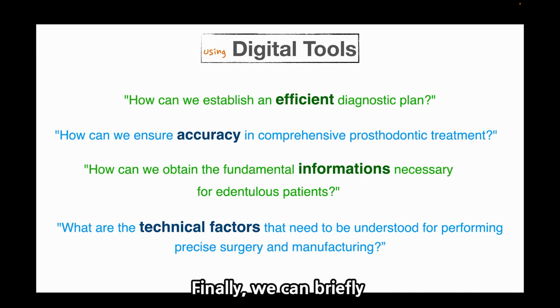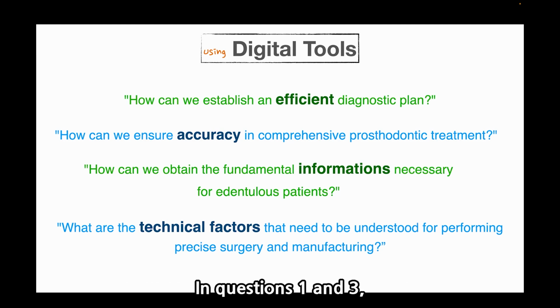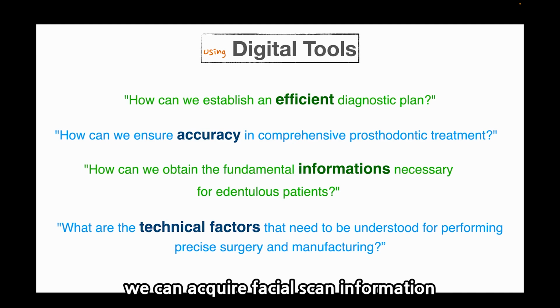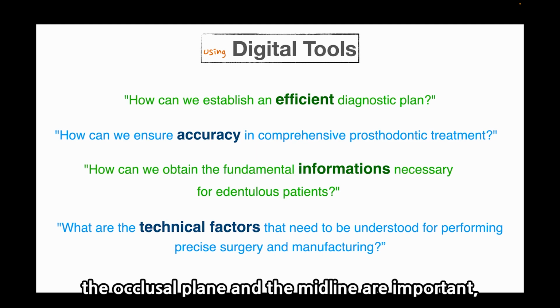Finally, we can briefly answer the questions from this lecture. For questions 1 and 3, we learned that with effective diagnosis, we can acquire facial information and set various reference planes; especially the occlusal plane and the midline are important.